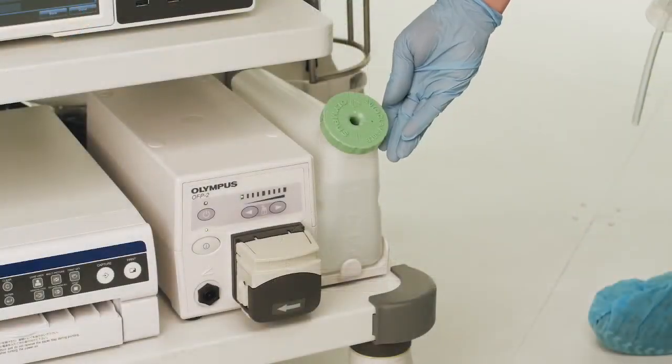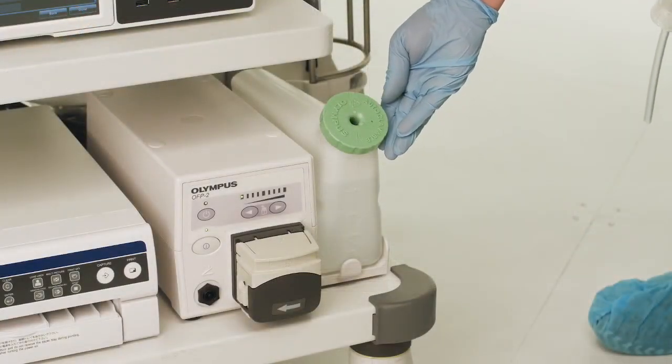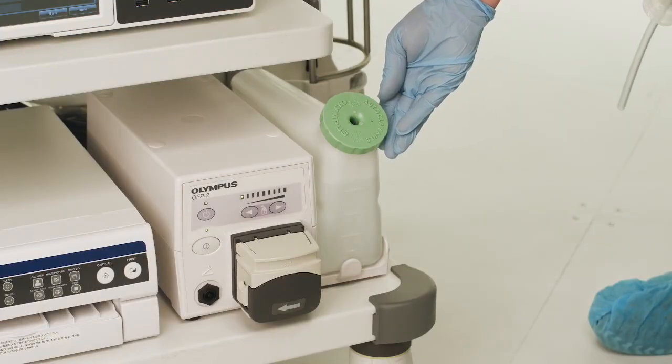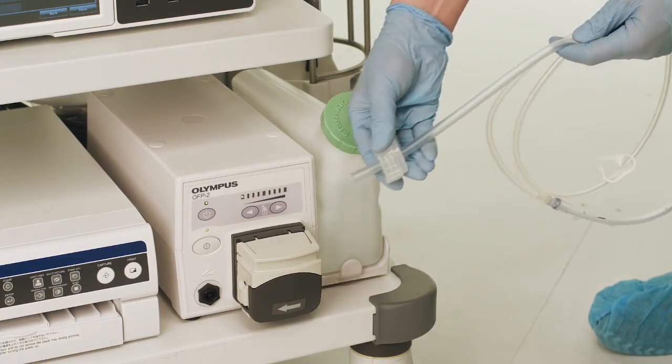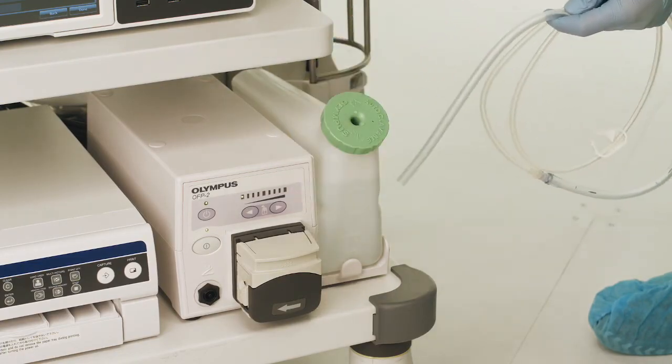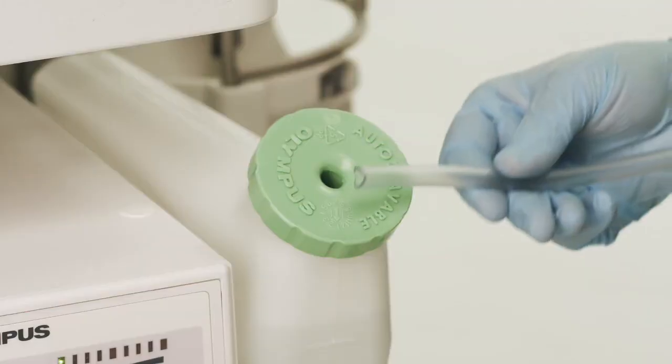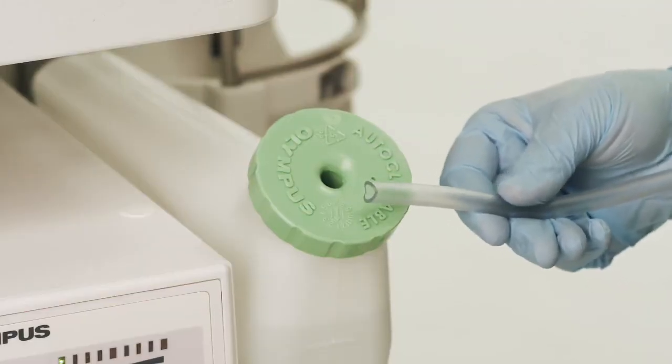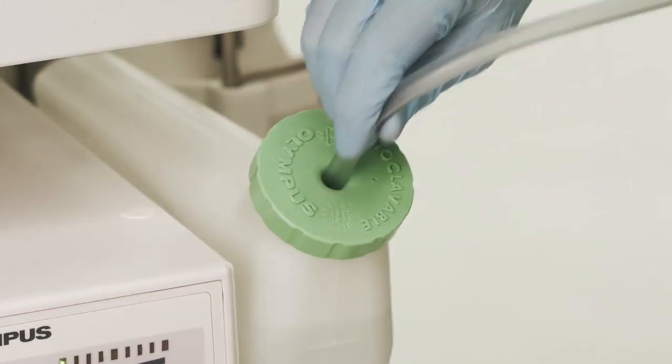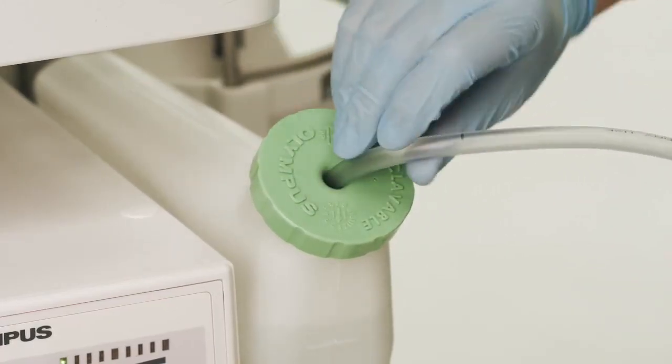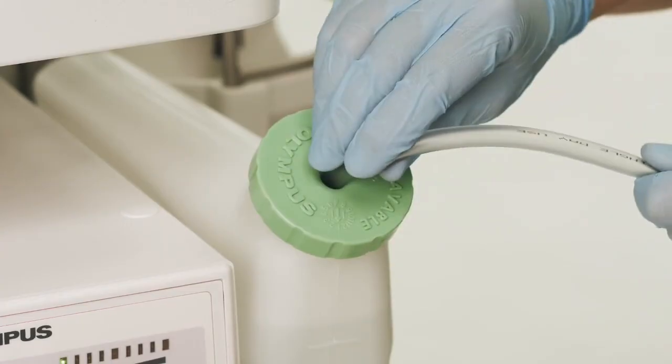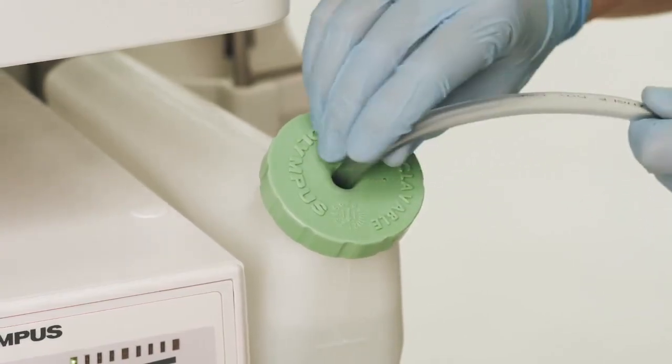If you will be using the water bottle provided for use with your OFP or OFP2 Olympus endoscopic flushing pump, then remove the plastic cap provided with the auxiliary channel water tube set and discard it. You will then thread the scallop cut end of the auxiliary water channel tube set through the water bottle cap on your OFP or OFP2 into the bottle up to the first indicator line marked on the tube.